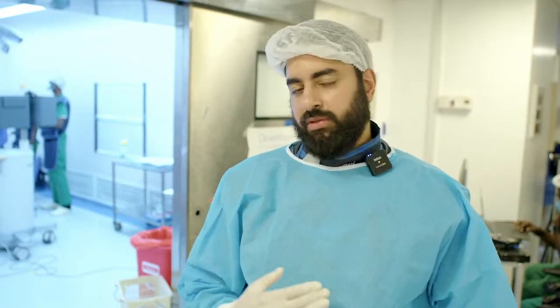The probe we're using here is a 1.7 probe. It allows us to get to the lower lobe quite comfortably with some little flexibility. The 1.1, we don't think it's going to give us enough sample size for this particular patient. And we will freeze anywhere between 3 to 6 seconds. We start slow and progress upwards as we check for bleeding.